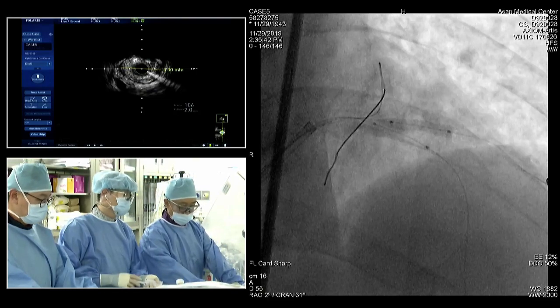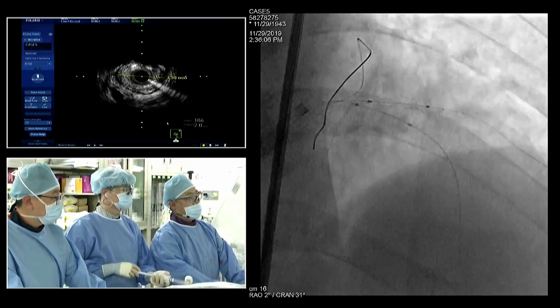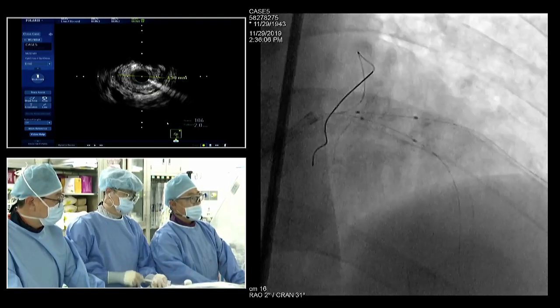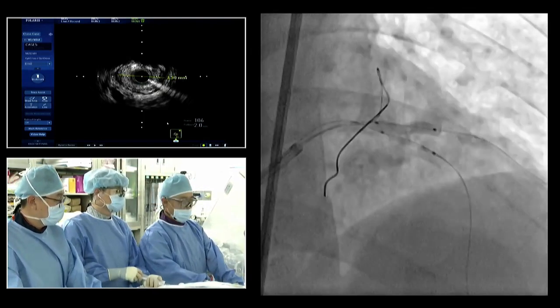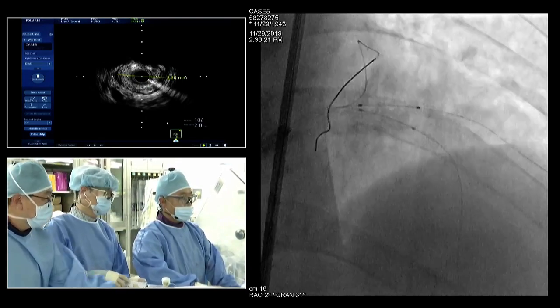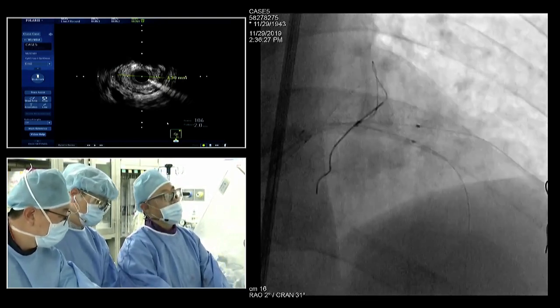I will do an inverted provisional, so stent from left main to diagonal, because the diagonal is quite the same size as the LAD, and then add a stent in the LAD in the T-stenting configuration. Of course, culotte can also be a good approach. What you are doing is also a good approach, I think. It's not a DK crush, it's a crush, but I think in your hands, crush is probably as good as DK crush.